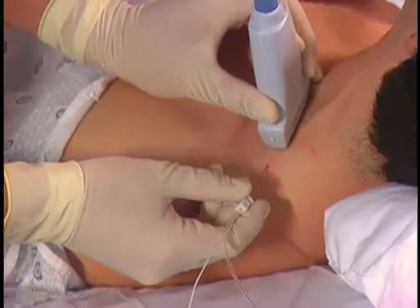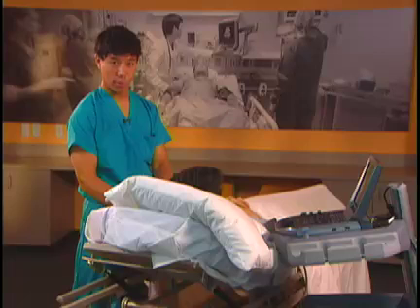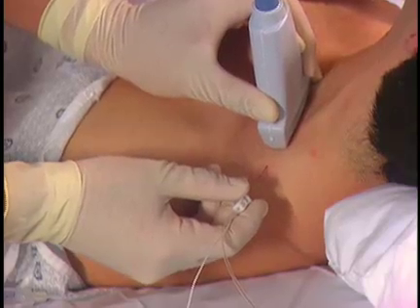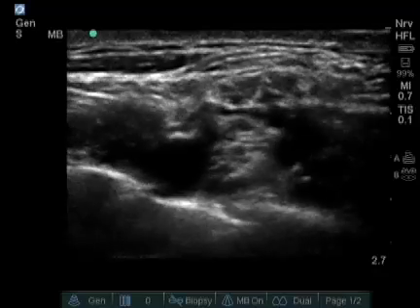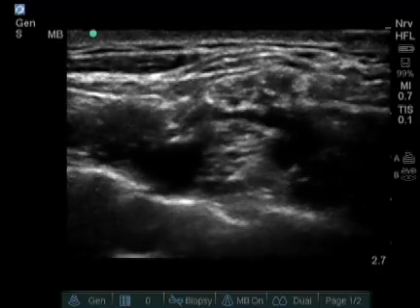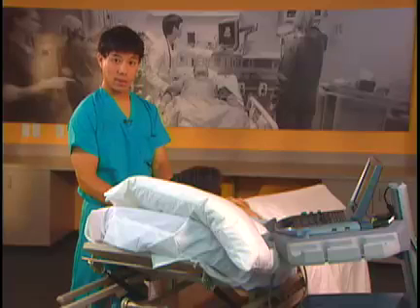It's very important to have the needle completely in plane with the ultrasound probe so it will be visualized during its entire length. Give some injection of local anesthetic, usually about one to two milliliters, to see the spread on the ultrasound screen. Injections below the nerves will push the rest of the brachial plexus more shallow, making the rest of the block easier. I usually inject about 20 to 30 milliliters of local anesthetic in the supraclavicular region.